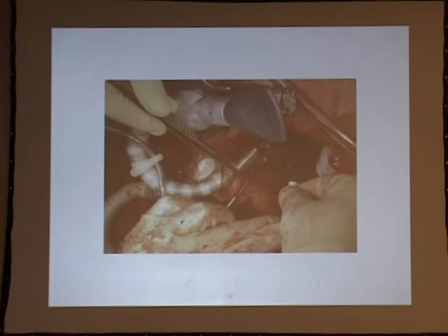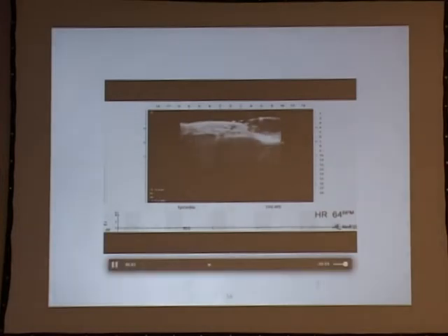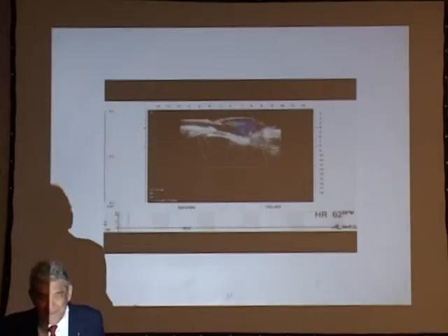Even for the right coronary, we can see this is the vein graft to the PDA. This is a big saphenous vein to the small PD, but we can see the anastomosis very clearly, like this.